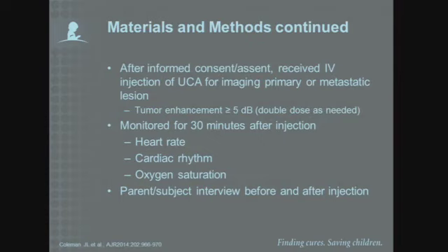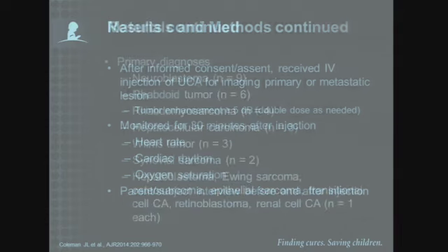In addition to our screening, we monitored all of our patients for 30 minutes after each injection. We monitored their heart rate, the cardiac rhythm, and their oxygen saturation. We also performed parent and subject interviews immediately before the injections and then again immediately after the injections to determine if any subjects experienced any reaction.